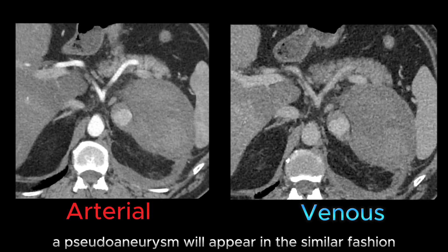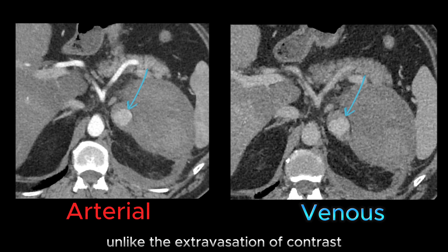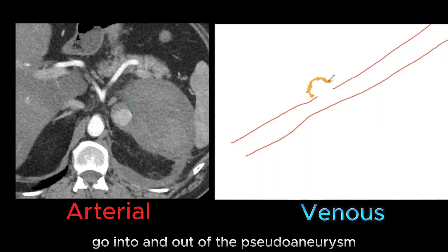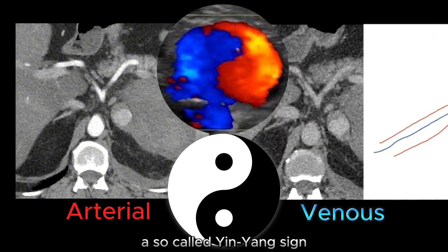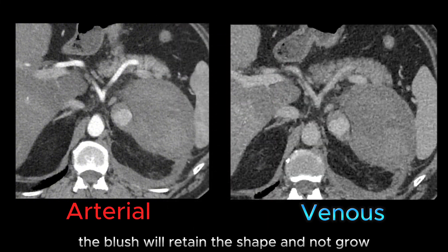A pseudoaneurysm will appear in a similar fashion. However, the form is often round and well demarcated, unlike the extravasation of contrast, since the bleeding is contained. This explains why we can see flow go into and out of the pseudoaneurysm on ultrasound — a so-called yin-yang sign. On the venous phase, the blush will retain its shape and not grow.